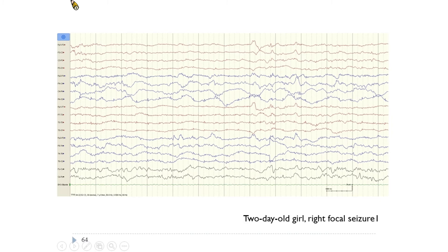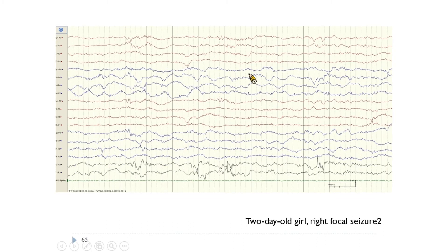This is a two-day-old girl with an uncomplicated birth, having right focal seizures at day two, and transferred to our ICU. In this EEG using a longitudinal bipolar montage at sensitivity of seven, there is obviously suppressed activity over the left brain and continuous activity of mixed frequencies over the right brain. The left side is flat; the right side is continuous.